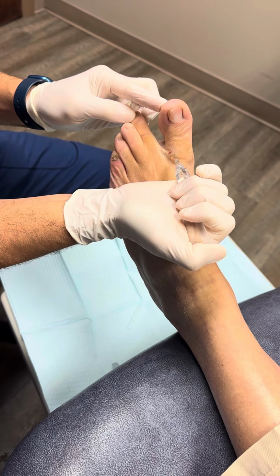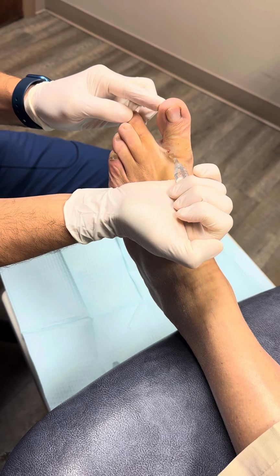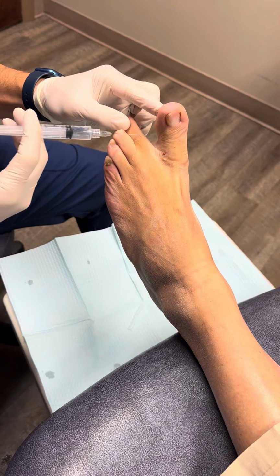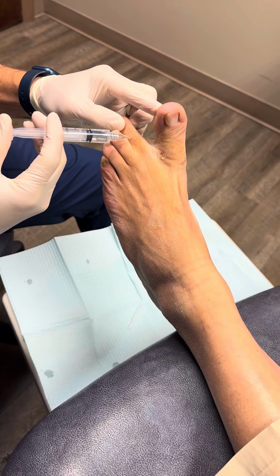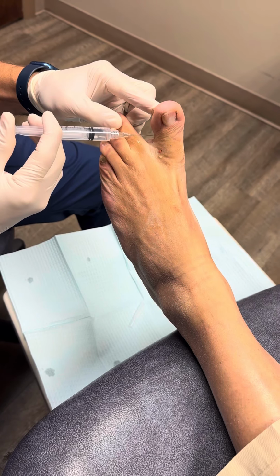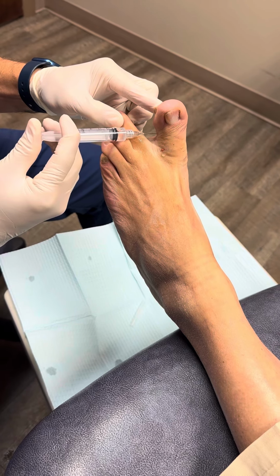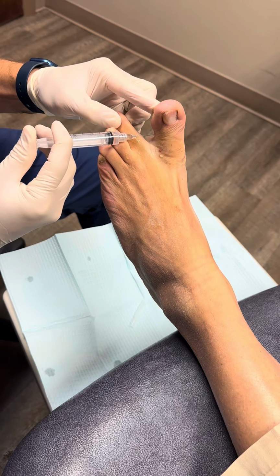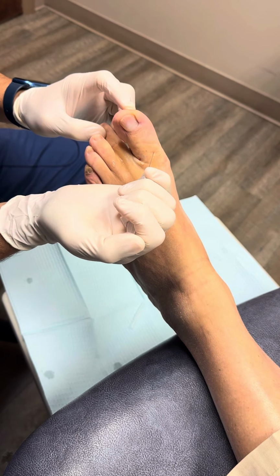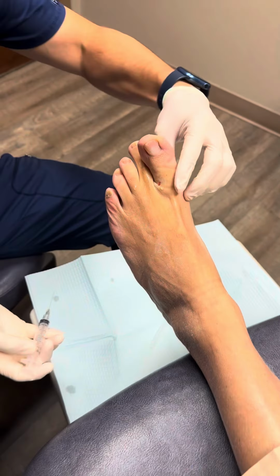Okay, sorry. Obviously, we don't want to induce pain, but trust me, this is a lot worse to do without anesthesia. This is a torture technique, so we do not want to torture patients. We're going to give a little more under here. The bottom usually is a little more uncomfortable. A little pinch, sorry. We're coming around the bottom, and as we go on the bottom, these bottom nerves can be very uncomfortable if they're not numbed up appropriately. And then we're going to give a little more on the top right here. We're going to go right on the side. And that's it. Did okay? Yep. Not too bad? Nope.